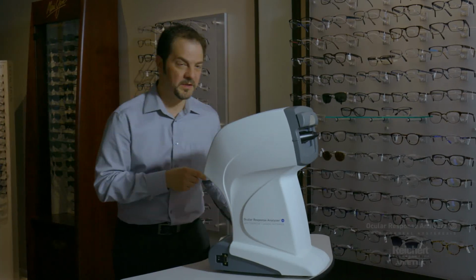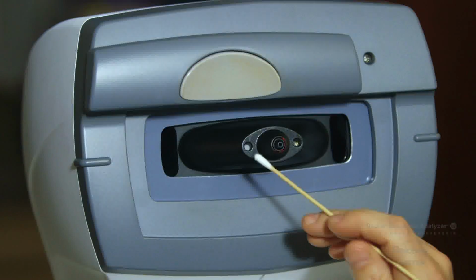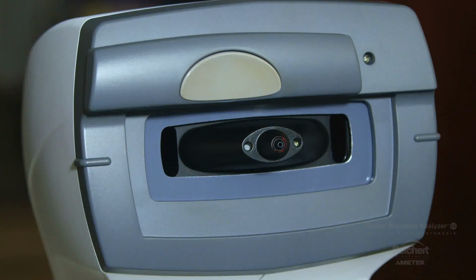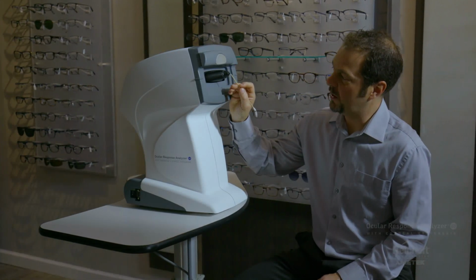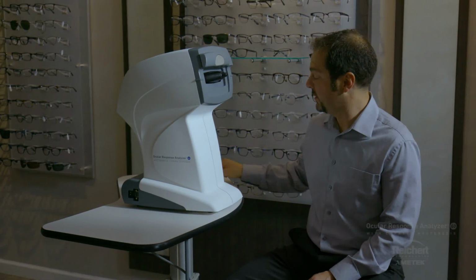Now let me show you how to clean these surfaces. There's two windows on the outside here. These are the alignment windows, and those need to be cleaned, and you can use alcohol to clean any of these surfaces because they're all glass. You're not going to harm them. Inside here, closer to the center of the instrument, there are two small windows, and they're behind this plastic cover, and that's what you need to use these long-handled cotton swabs to clean. And then right here in the center, this is the actual air tube, and that's what you use the pipe cleaner to clean. So let's go ahead and conduct the cleaning.